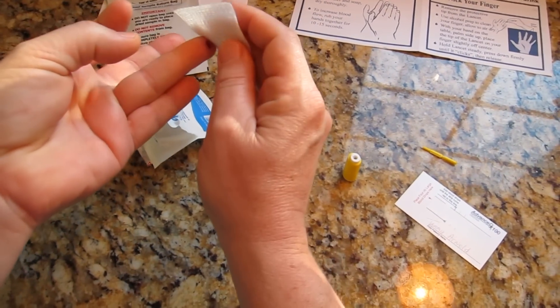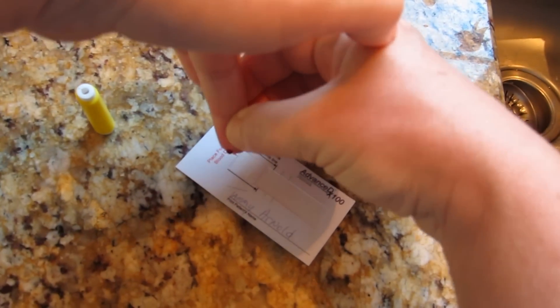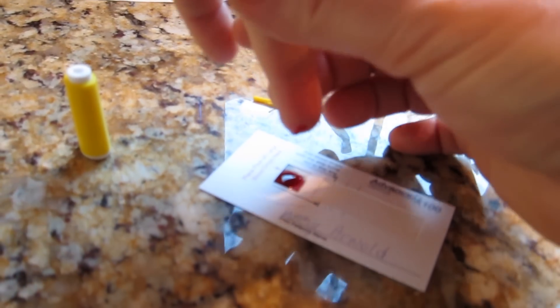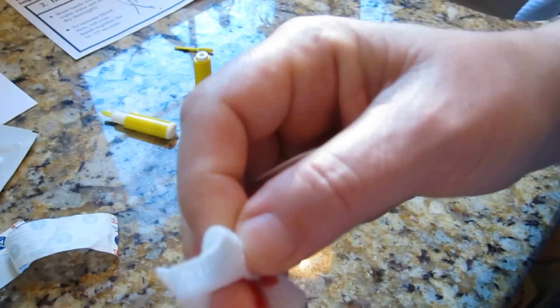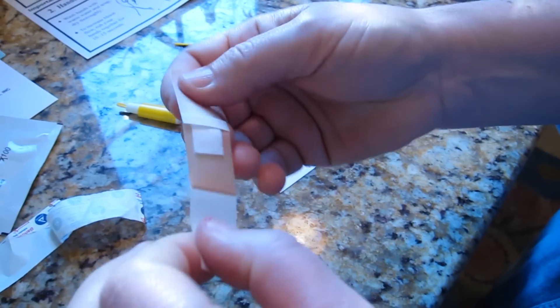Wipe off the first drop of blood with the sterile gauze pad, then place four large free-falling drops of blood into the box on the left of the Advanced DX card. Rubbing your finger will help the blood drop into the box. Try to drop them in continuously and do not stop and wait between drops. After your fourth drop is on the card, wipe your finger and put the band-aid on.